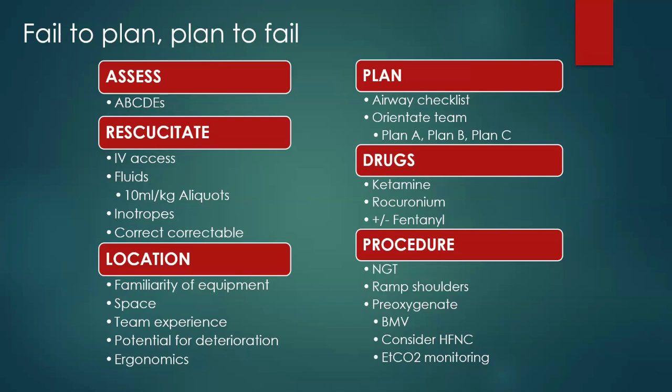Whilst you're doing your assessment of your ABCDEs, it's important to also resuscitate this patient as best as you possibly can before intervening with the intubation. Intubation itself is not a benign process, and you will be worsening the patient's acidosis. You're going to be causing hypoxia, increases in CO2. The drugs that you give are also going to have various forms of cardiac effects, vasoplegic effects potentially as well. So if you resuscitate your patient to the max that you possibly can, it's going to improve your outcomes when you inevitably have to intubate these patients.